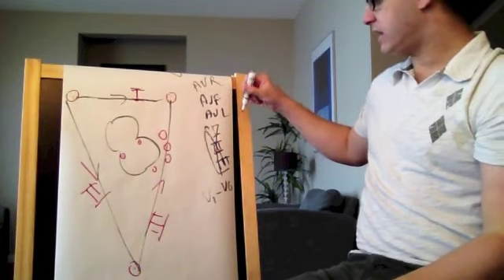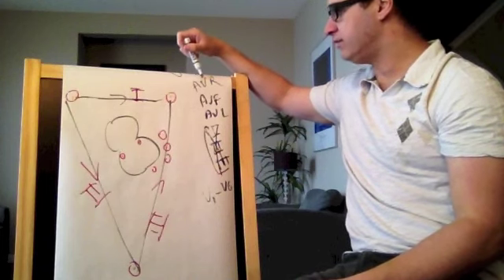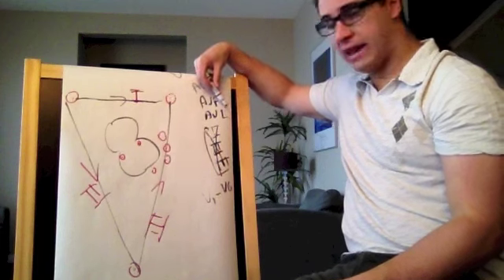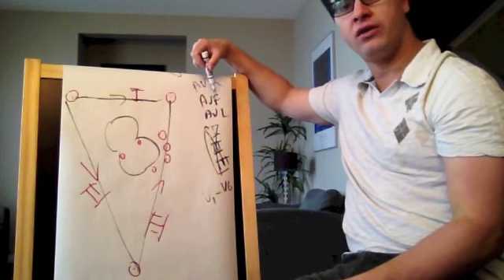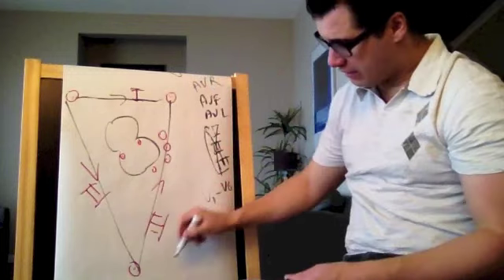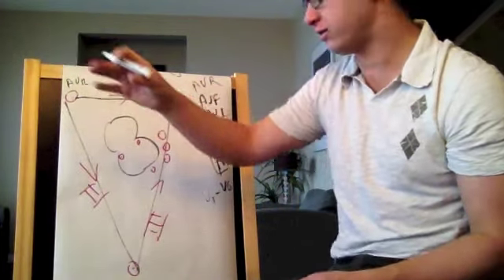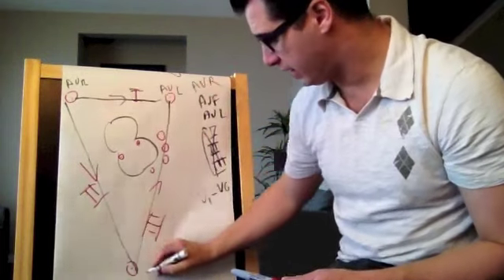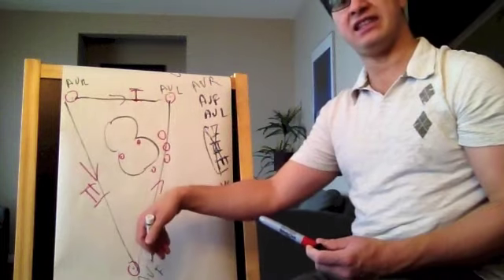So AVR, AVL, AVF stand for augmented voltage right, augmented voltage left, and augmented voltage foot. Augmented voltage right, why the right? Augmented voltage left, what's at the left? And augmented voltage foot, so when it's down.